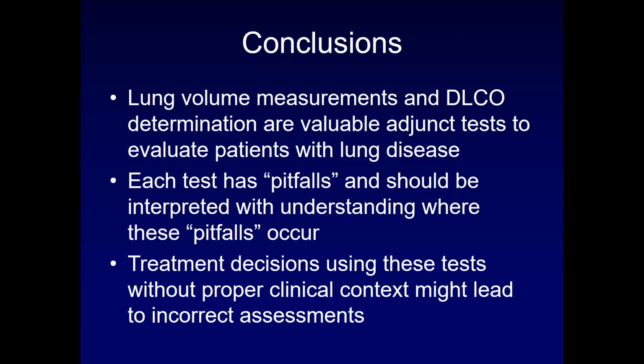And lastly, and most important for our patients, treatment decisions using these tests without a proper clinical context and understanding if the test is an accurate one might lead to an incorrect assessment and the wrong treatment.